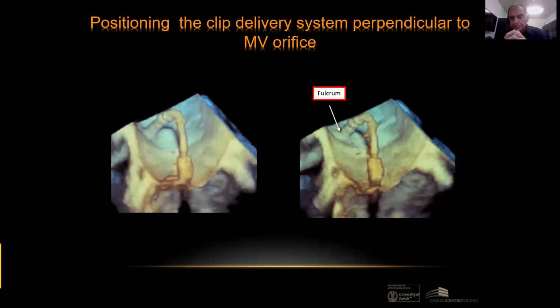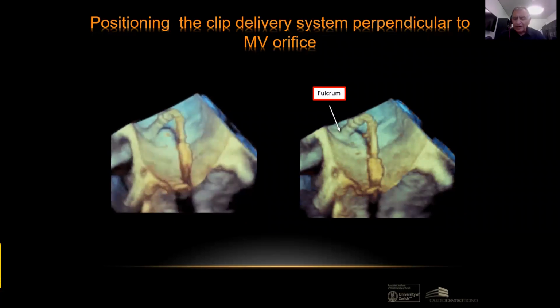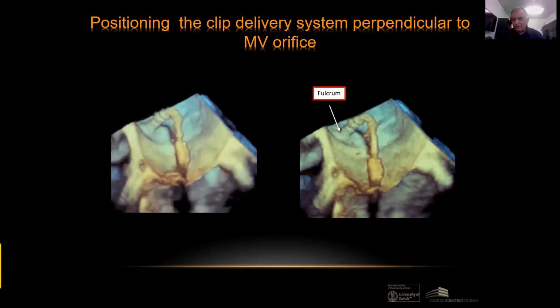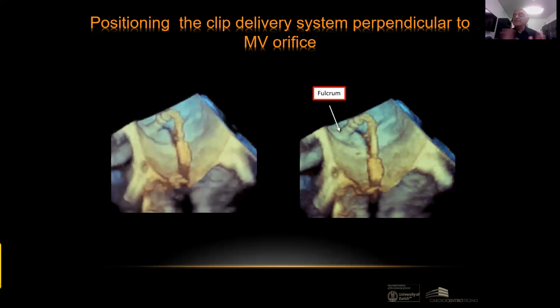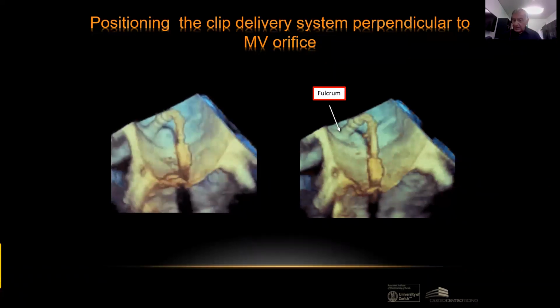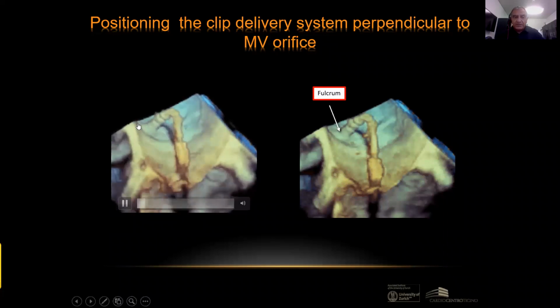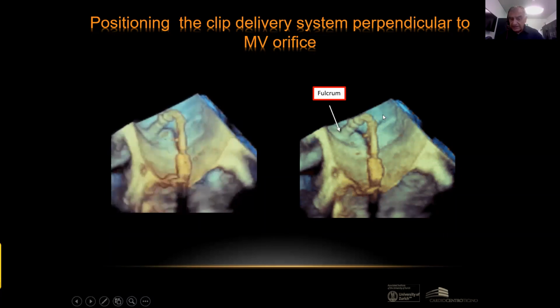And we realized this when we started to use the clip for the tricuspid valve. Using the clip for the tricuspid valve, we don't have this fulcrum anymore. So the catheter in the right atrium is very unstable. It's much more difficult to clip the leaflets because the catheter is moving. In this case, the catheter is pretty fixed, you see, and what is moving is just the clip delivery system here.